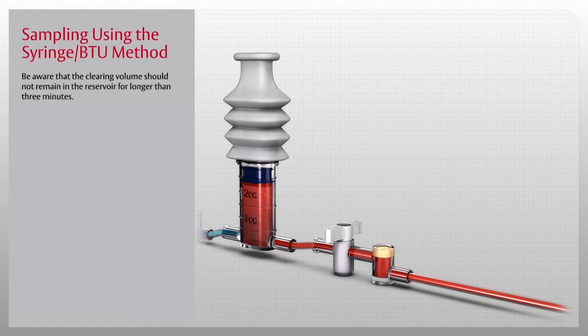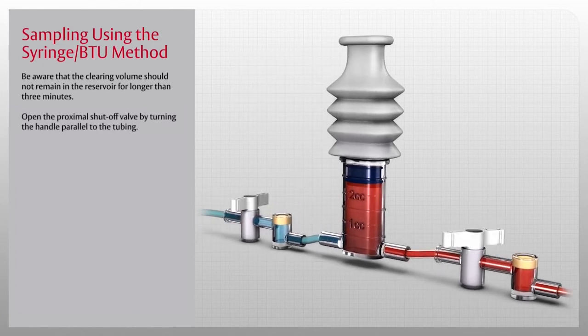To re-infuse the clearing volume, first open the proximal shutoff valve by turning the handle parallel to the tubing.